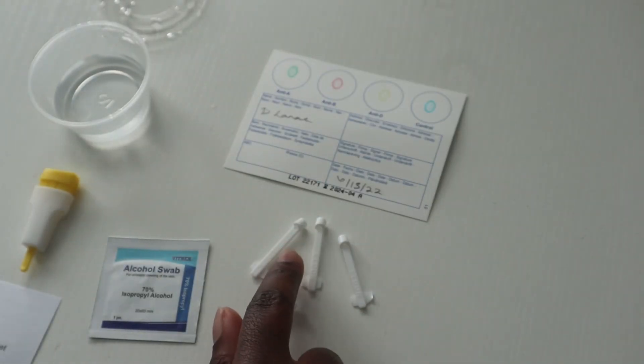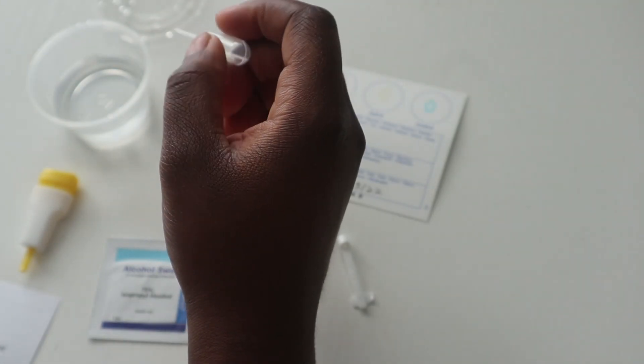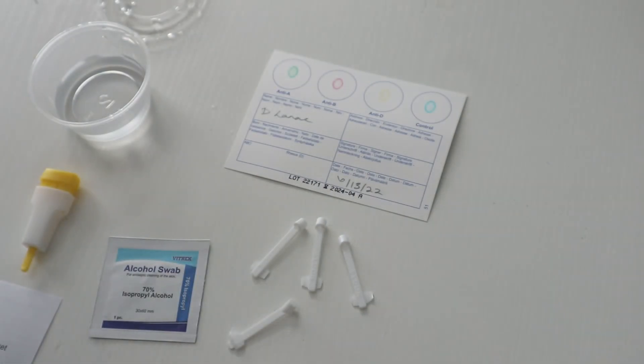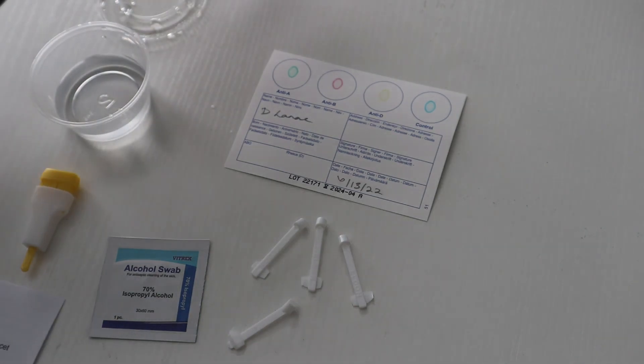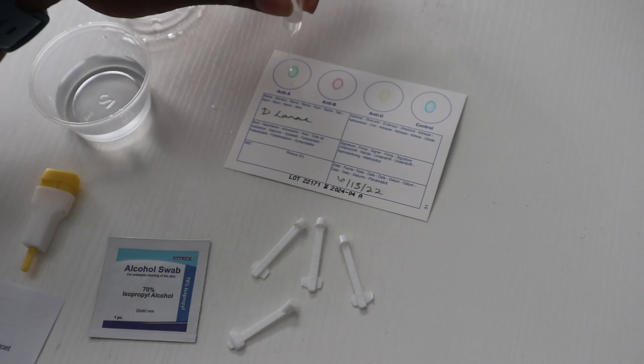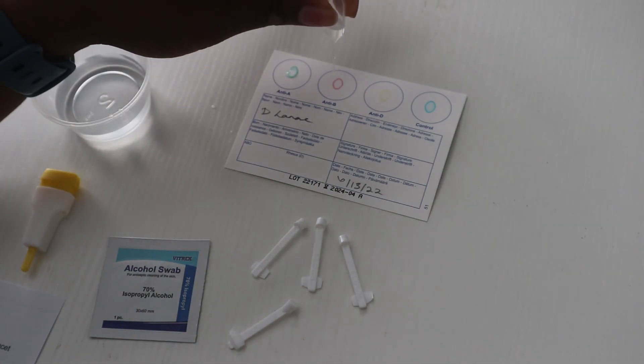I have separated the Elden sticks. The next step is to take water and hold the pipette vertically, then add one drop of water onto each circle without touching the circle.